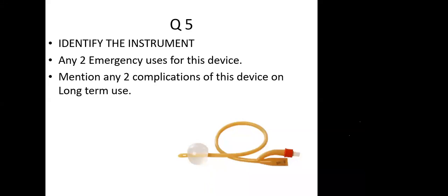Okay. What are the contraindications of this device to be used in an emergency? When will you not use a Foley's catheter? Sir, urethral injury. Okay. Why will you not use a Foley's catheter, sir?